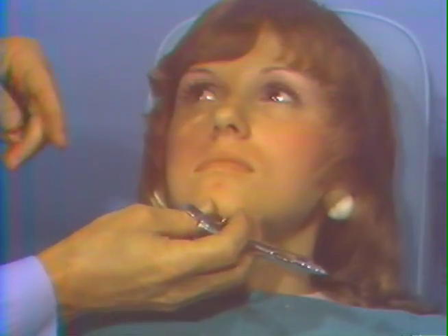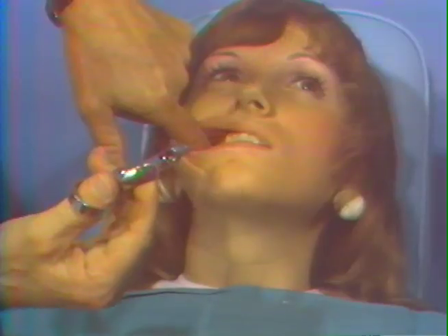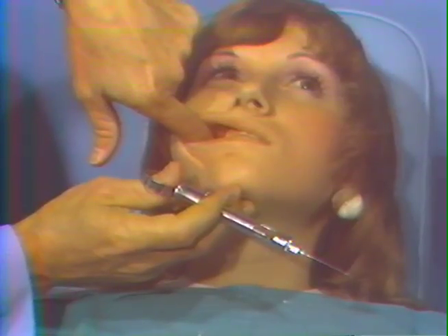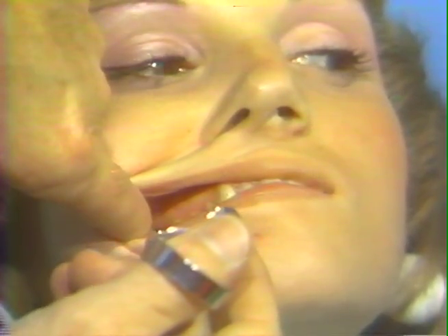Now tip your head up a little bit more, open a little bit wider, close your mouth a little bit, relax your cheek, don't let me turn your head, relax your cheek. The posterior superior alveolar nerve right side, once again, distal to the zygomatic process of the maxilla. Tip your head down just a little bit, that's it, like that. The needle is placed posterior to the zygomatic process, retracting with the finger and the needle in this manner.